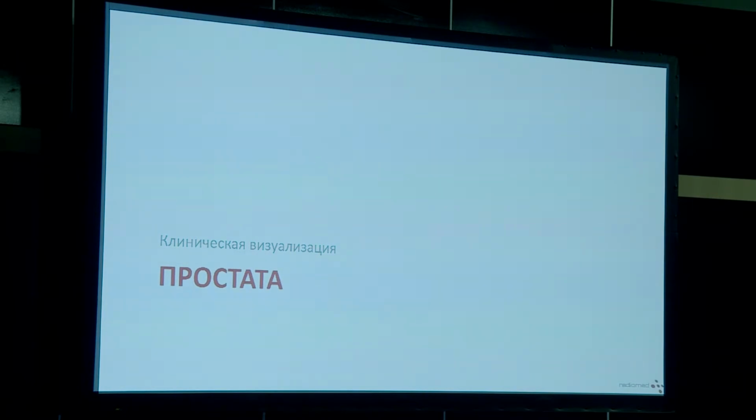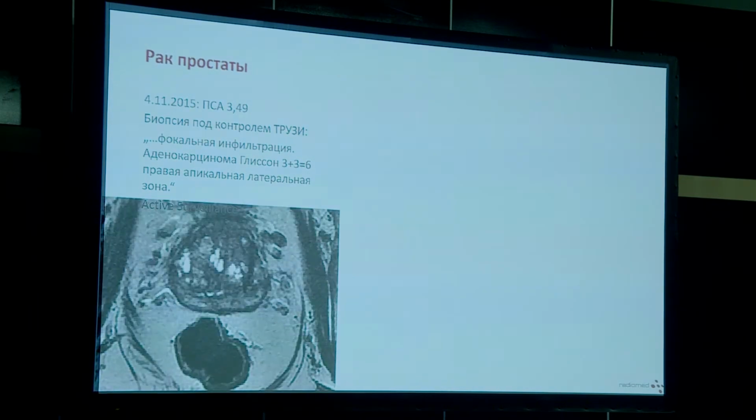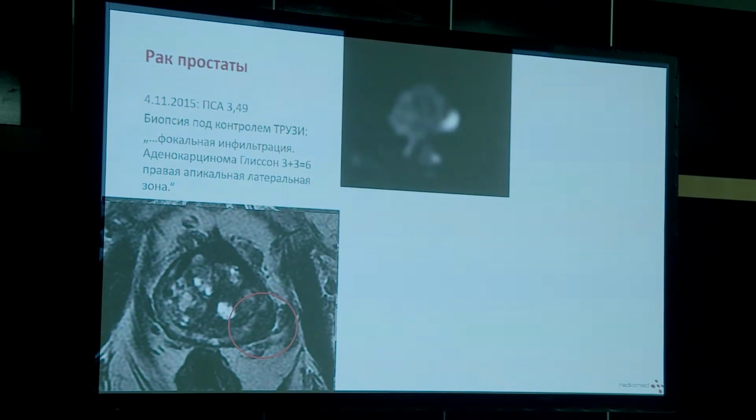Next, let's talk about prostate imaging. I'd like to show you a case from a patient with PSA of 3.5, histologically proven focal Gleason 6 cancer to be on the right side. We did T2 imaging and we didn't find a lesion actually on the right hand side, but we did find a lesion on the left base of the prostate.